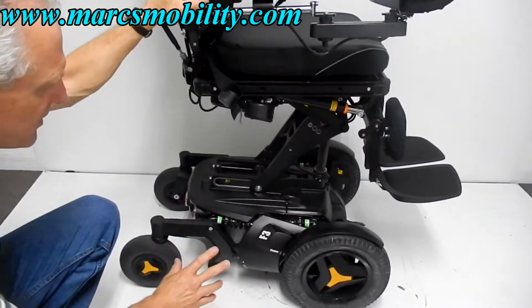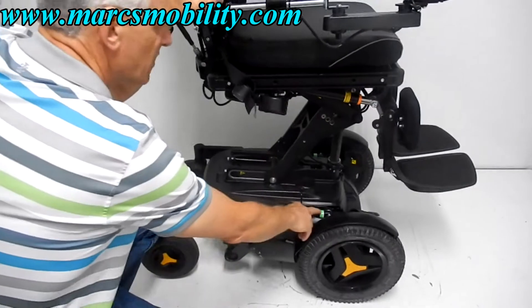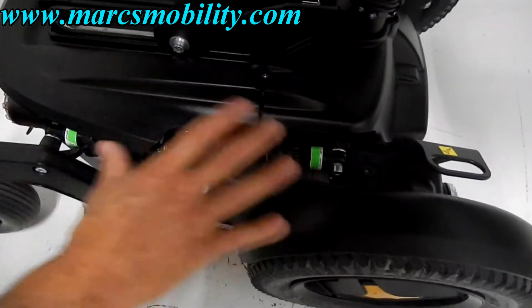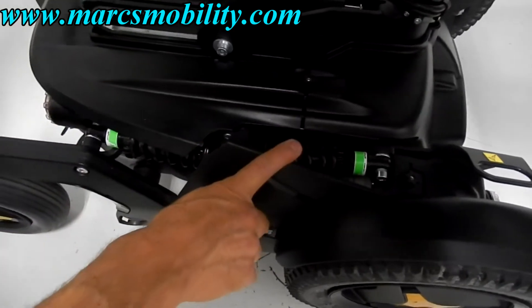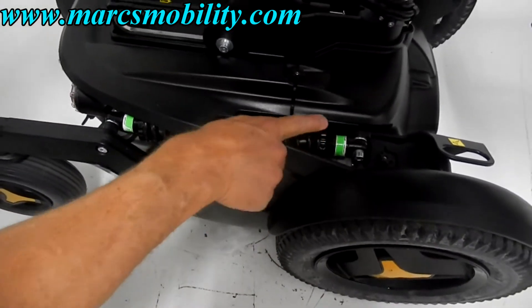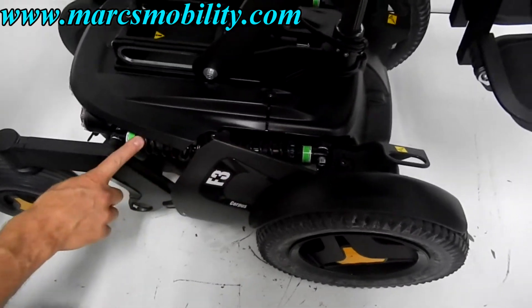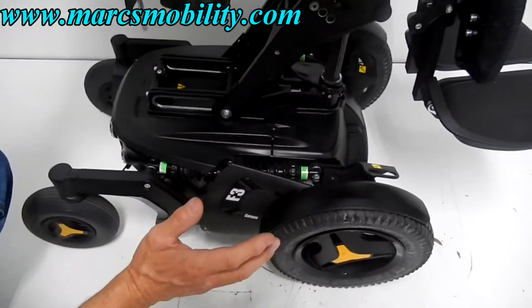Now that we've got the seat elevated, we're going to talk about the suspension. You can see the suspension here for the front and the suspension for the back — you've got this on both sides of the chair. This suspension can be adjusted by turning these rings right here. If you turn the rings, the springs are going to get tighter on both sides, so the suspension can be adjusted to whatever tension you want.